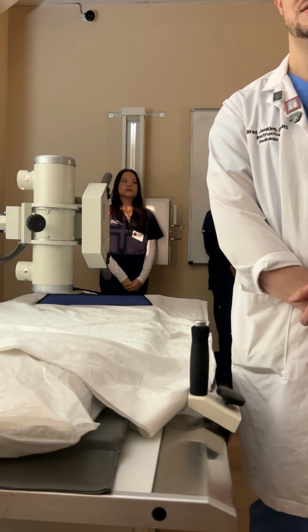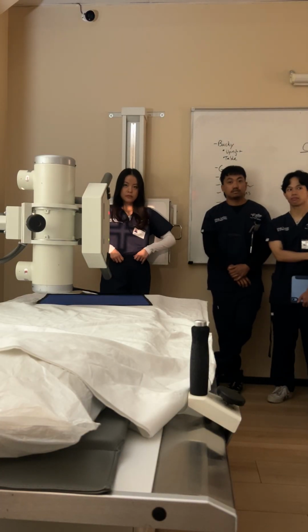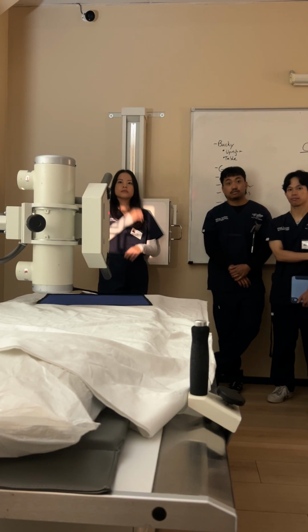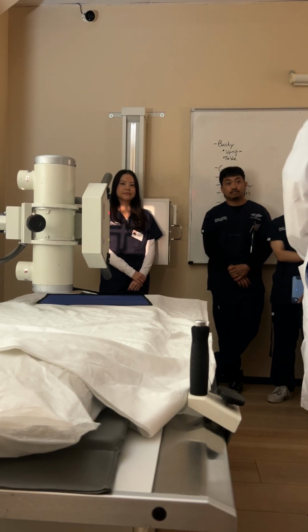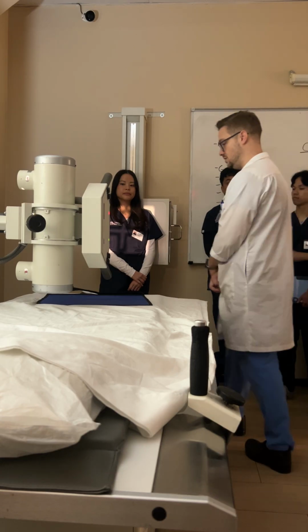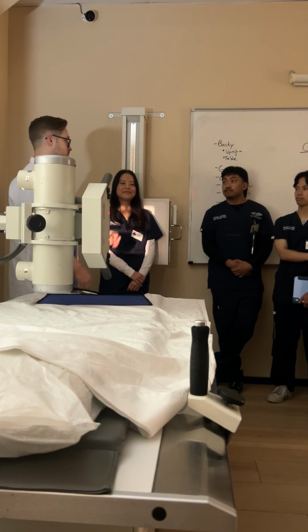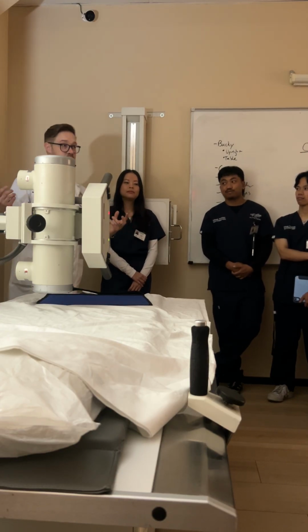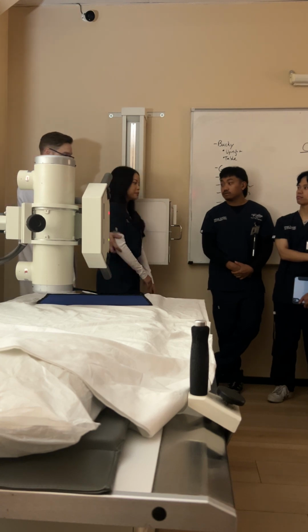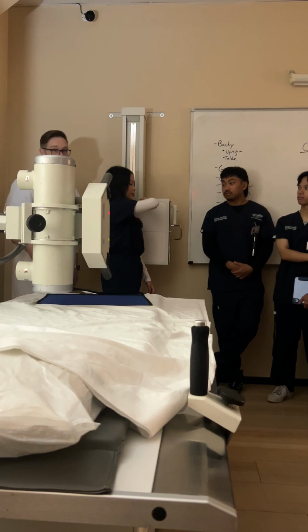Anything to add? Go ahead. If they can't lift their arms up, what would you do then? Best you can. Oftentimes, let's pretend that Victoria is a 90-year-old woman. She has badly arthritic shoulders. Sometimes, the best she could do is about right there. What do I do in that situation?